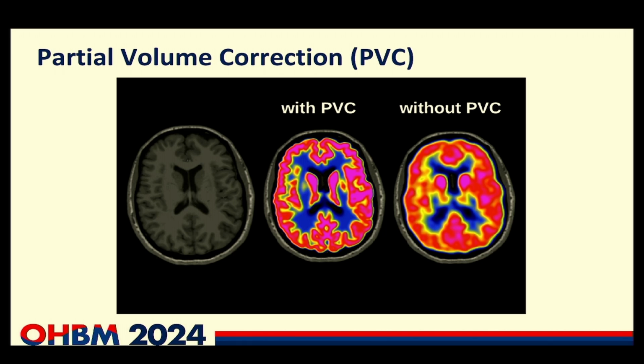On the second one, it's difficult to say. It depends on the scanner as well, the resolution, but in general, smaller regions are more noisy. If you have noisy regions and try to do partial volume correction, those regions will become even more noisy, and that means that it will be very difficult to do subsequent kinetic modeling or quantification on this.